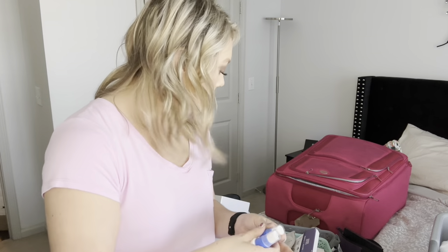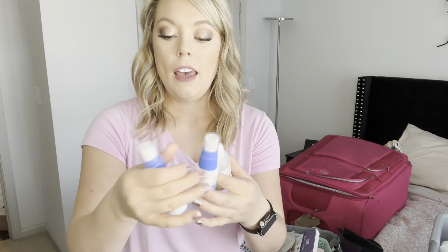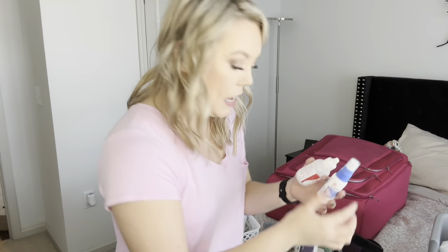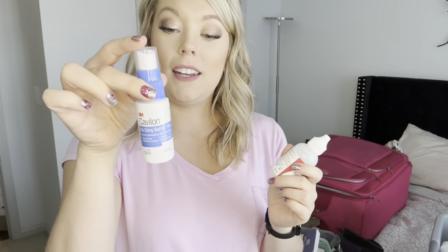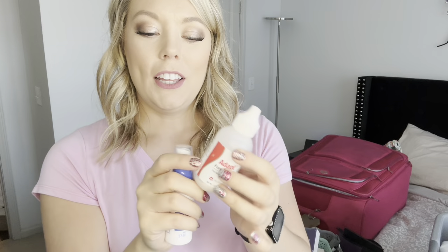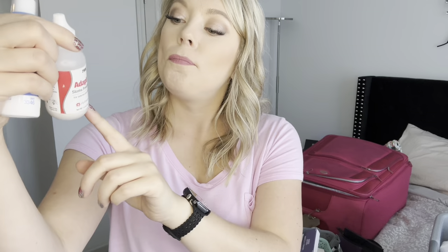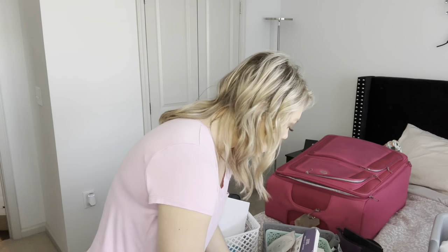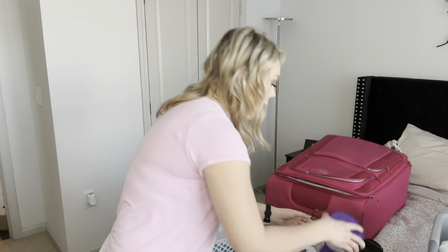Next up is the stoma powder for when I need to do the crusting technique, which I talked about in my previous video. There's also the barrier film spray — this one is almost empty but I have one on order, so I'll bring the fuller one. I check the side to make sure I have enough for several bag changes — I feel like I do, so I'll go ahead and bring the fuller one.